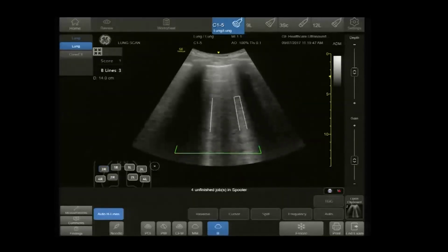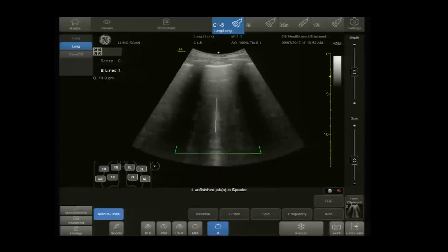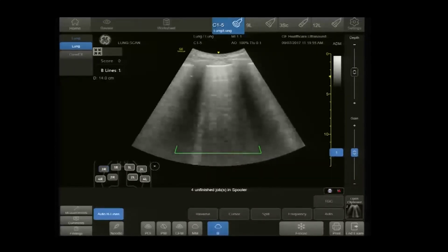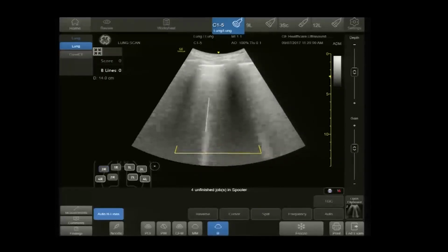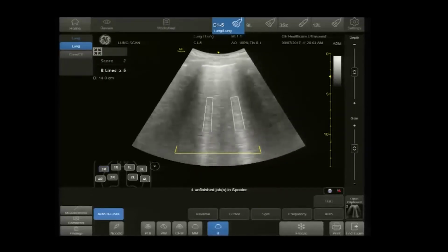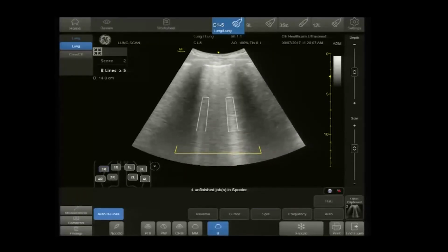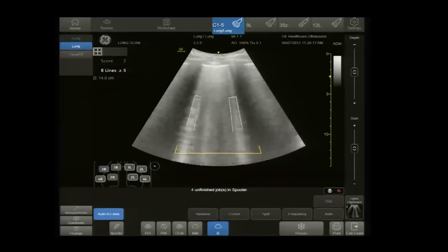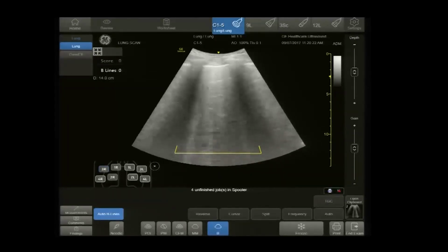Okay. Another thing that can affect it is if there's just too much noise. Say maybe the gain is too high, and I showed this a little bit earlier. Notice as I increase it, eventually the system is having trouble differentiating those B-lines from the surrounding noise floor. So is my eye. So in that case, the quality indicator is yellow, saying, okay, if this is the best you can do, here's your results, but you should really think about how much confidence you have in those results, because the quality indicator is telling you to be cautious.